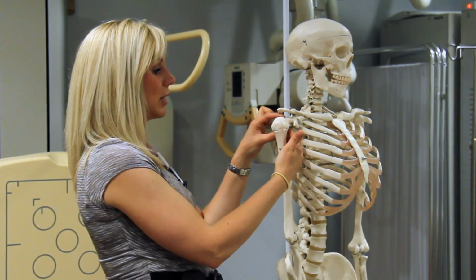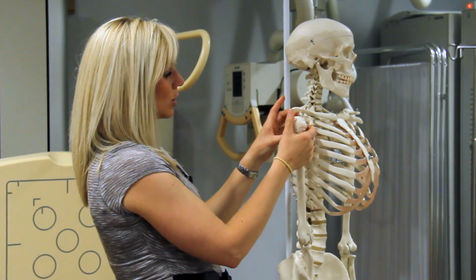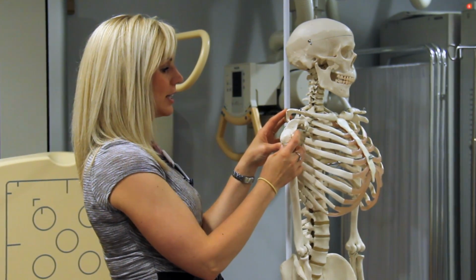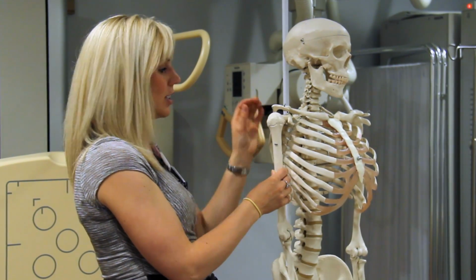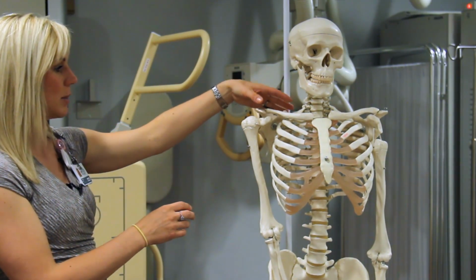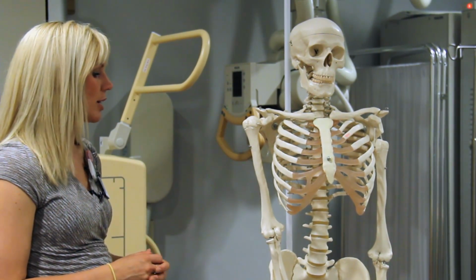It's about the same level as the glenoid fossa. So we can see that relationship very well in the Y view. And we also see the actual glenoid cavity or glenoid fossa that helps to create the glenohumeral joint when it associates with the head of the proximal humerus. So as far as scapula, there's quite a bit more anatomy and terms in relation to the clavicle. Lots of different projections that we can use there.